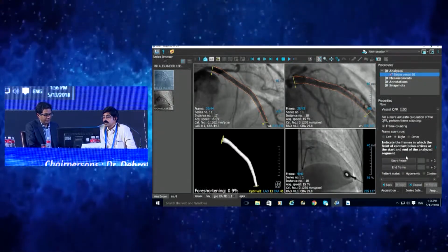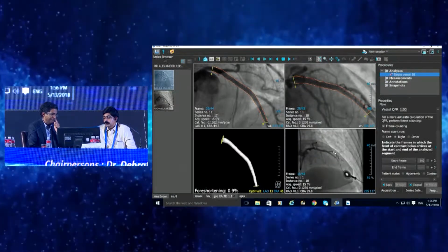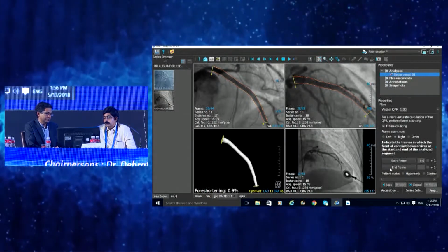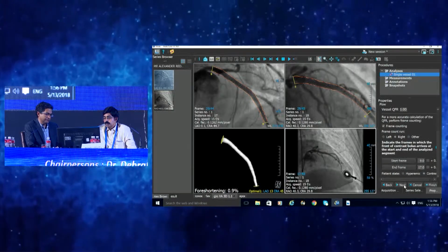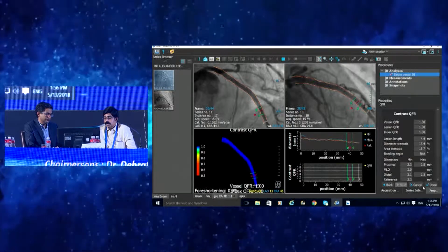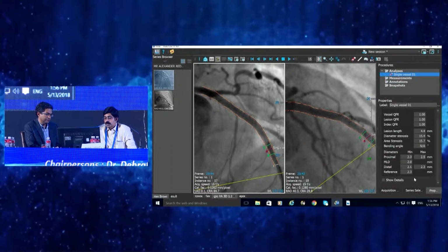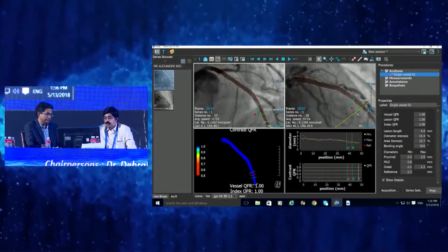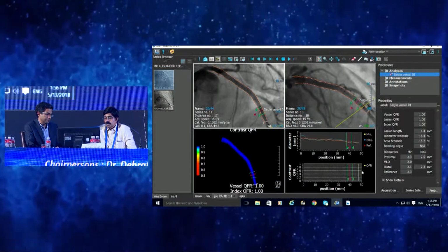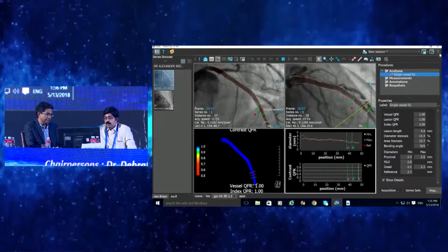I think that means it has gone from 0.8 to 1, it's quite useful and important. In 3D, you can do a three-dimensional rotation of the LAD picture so that you can also appreciate anything. And meanwhile, this FFR we can calculate, but we want to run through once, up, down. That same 3D you can scroll up, down. Below, the index QFR, just keep moving that red one. Okay.